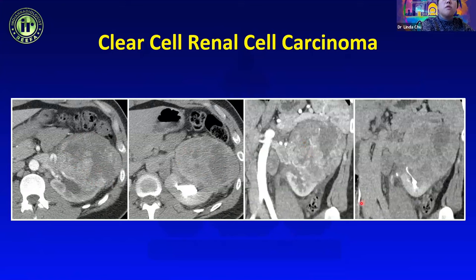Papillary RCC is the second most common type. As opposed to clear cell, which enhances avidly on arterial phase, papillary RCC tends to be a hypo-enhancing mass and also tends to be T2 hypointense, as opposed to clear cell which is T2 hyperintense.